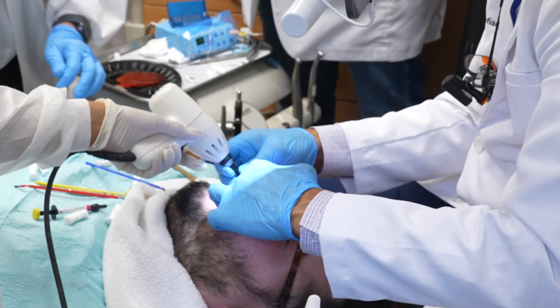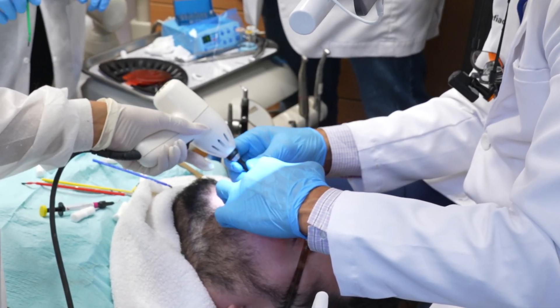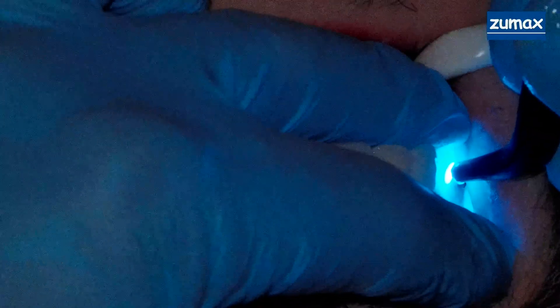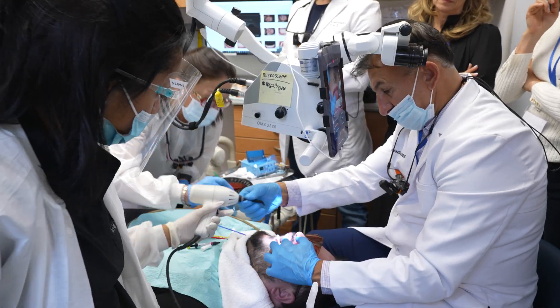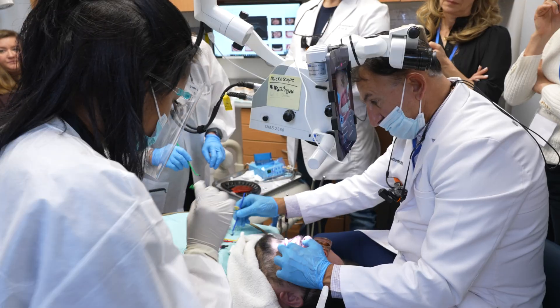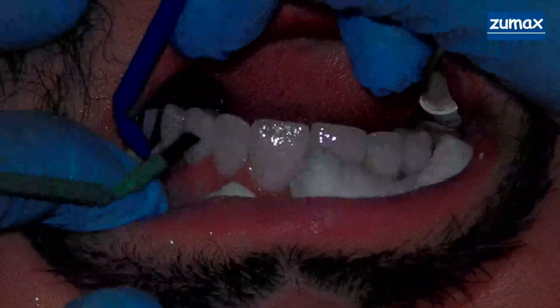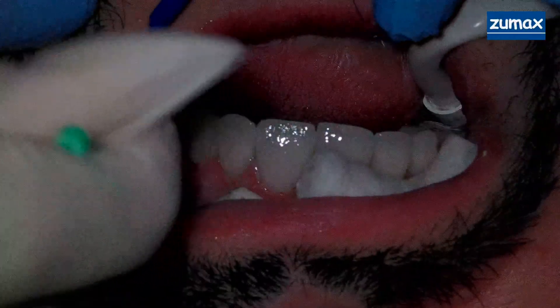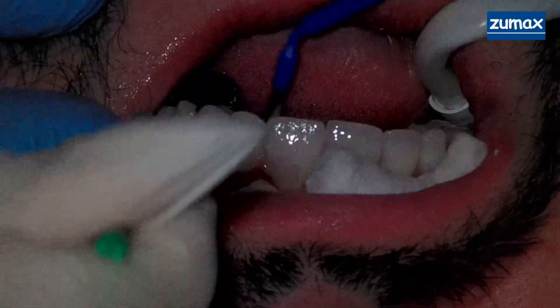See how I balance it? I push it to make sure I'm all the way in and lock those guys in. I'm going to do the same thing on number 12 because that one's dancing a little bit. I want to get all the cement off 13 because I'm going to have to take a final impression of that one. So no bonding on number 13 at all.